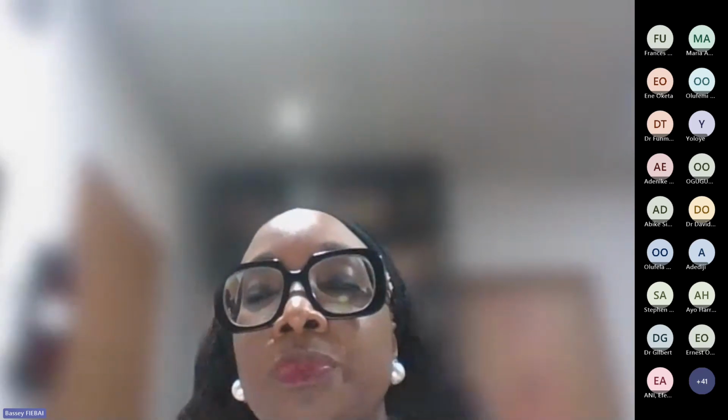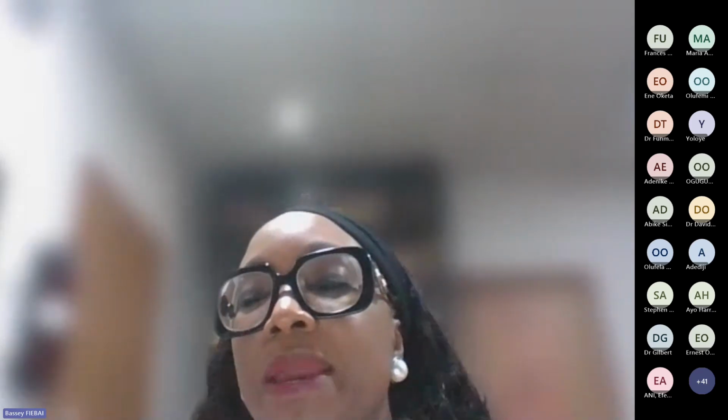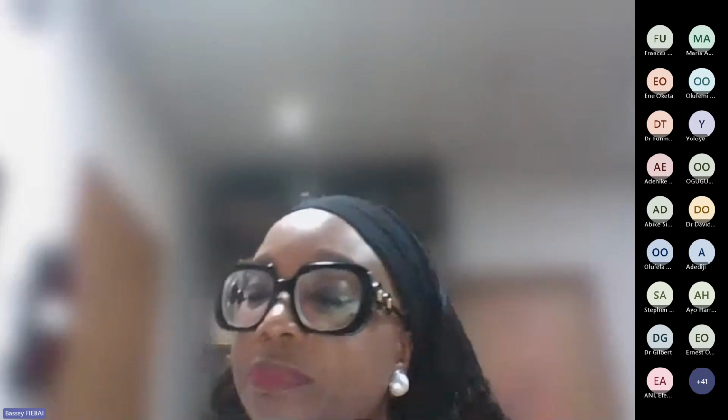But this just points to the fact that you're likely dealing with such a lesion, based on the amplitude of your A-scan spike and the echo texture, where you see the extremely hyperechoic dot lesions in the mass itself. Does that answer your question?